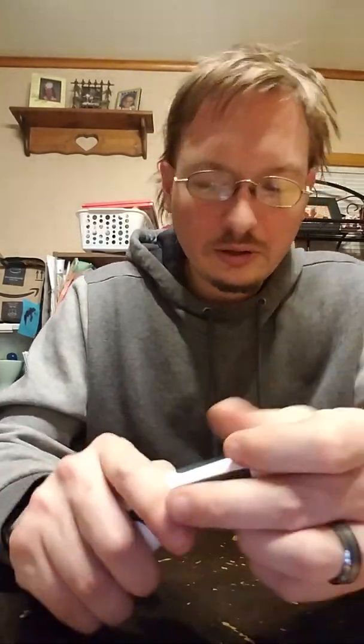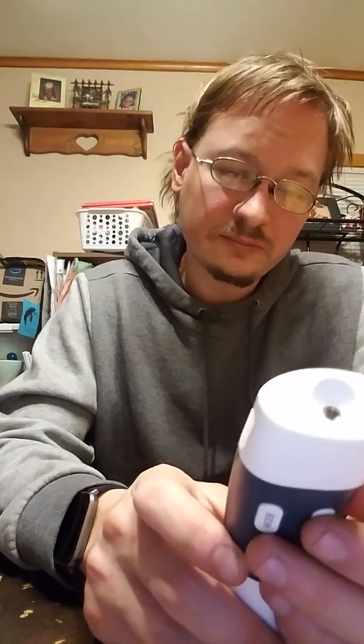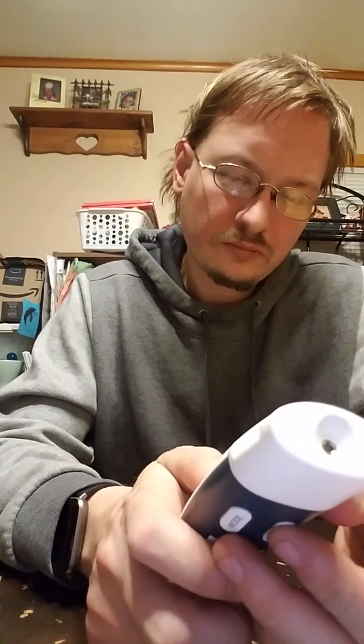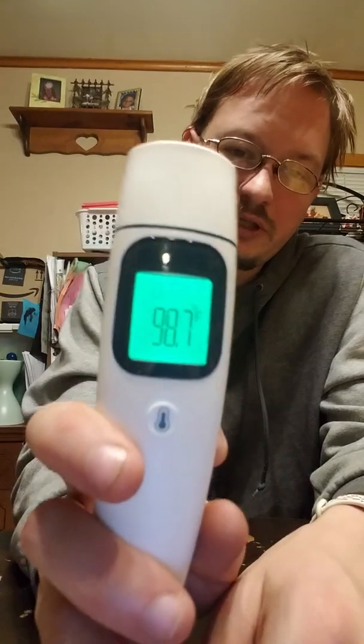I'm not getting sick because I actually feel really good — I'm just sweating in a sweater. It does have a memory function. As you see there, it can scroll through each one — three, four, five, six. I've only done it five different times. So I'm going to put my finger in the end and try this out. 98.7 — there we go. See, I'm not sick.